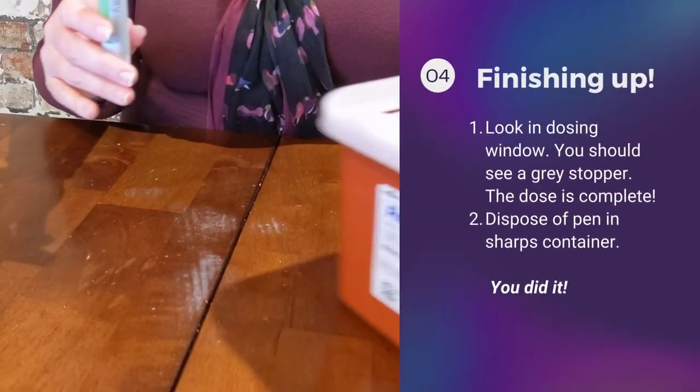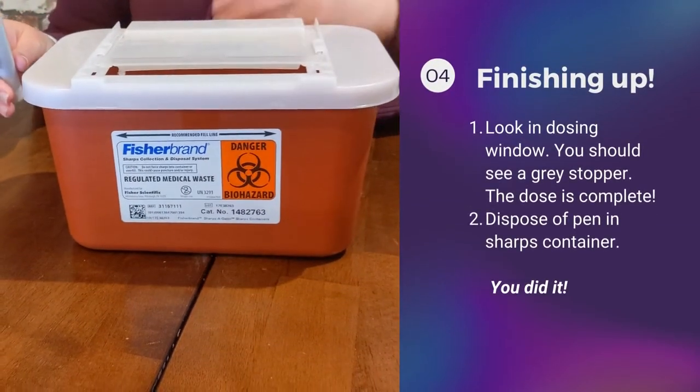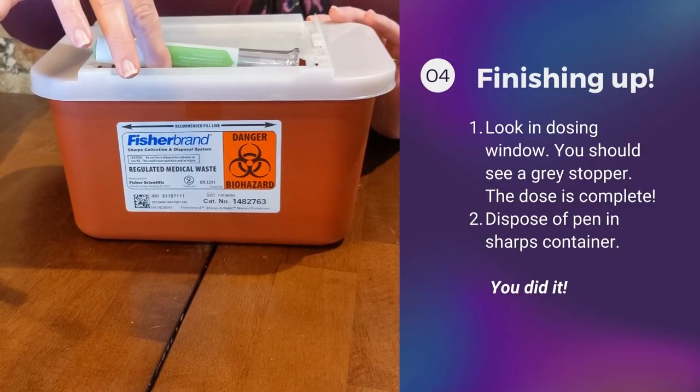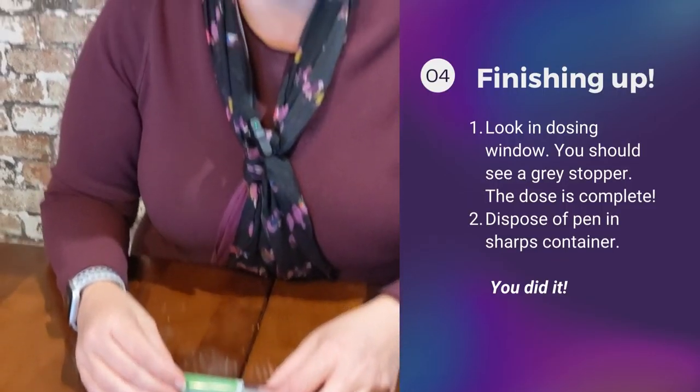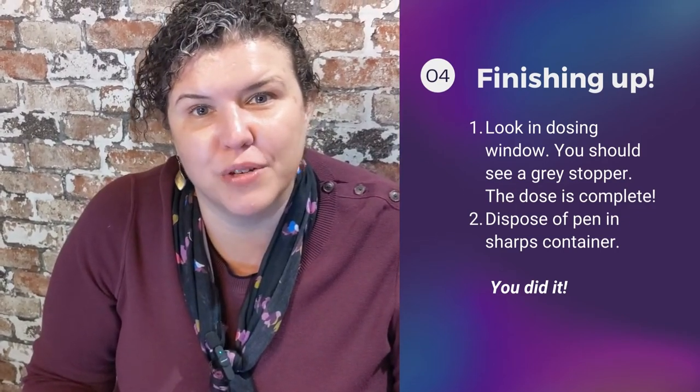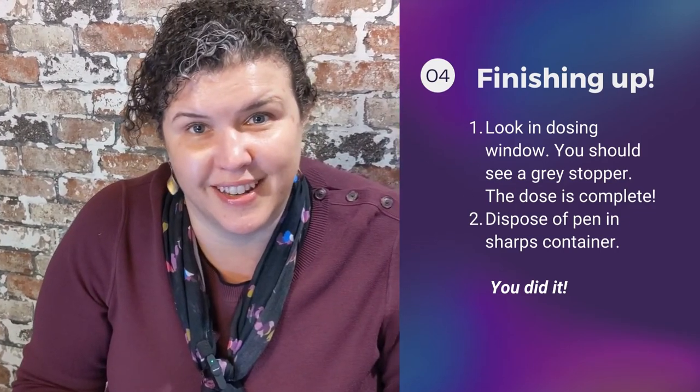As it does contain a needle, you want to get your sharps container out and dispose of it in the sharps container. And that is it. Thank you so much. I hope this helps you give your first dose of Trulicity.